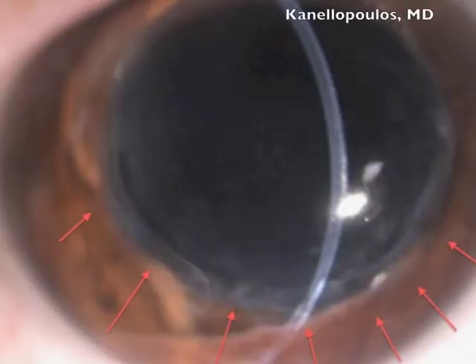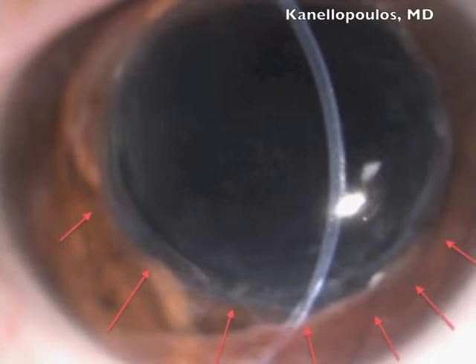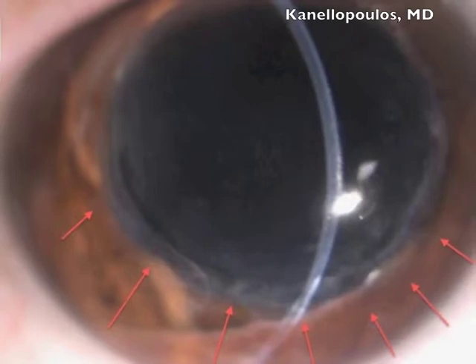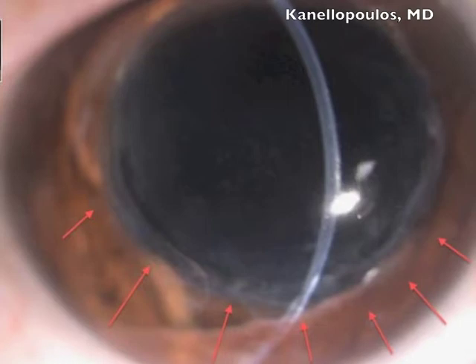This is quite an interesting case — a 72-year-old lady. She had 24 years ago a very successful graft for keratoconus that, as you can see, subsequently also had cataract surgery. She has very severe astigmatism over 20 diopters, and as you can see here, the graft-host interface inferiorly has had a quiet shift there from, obviously, persistent eye-rubbing.